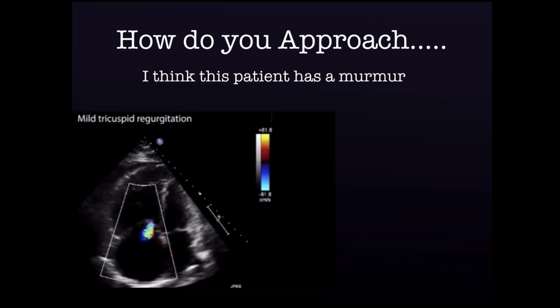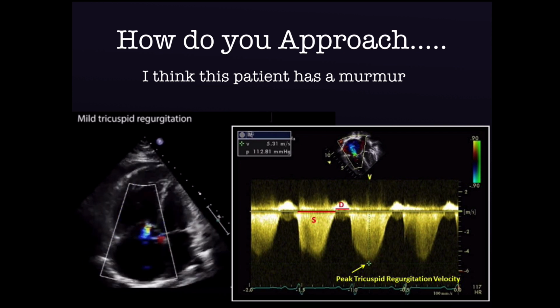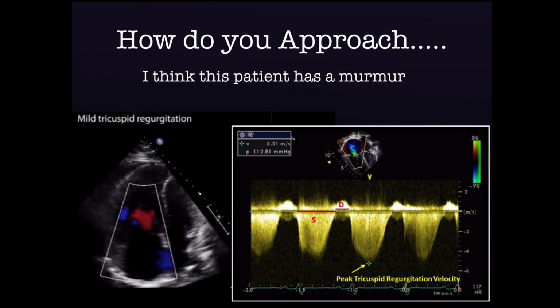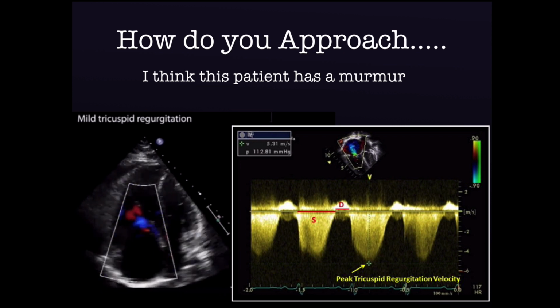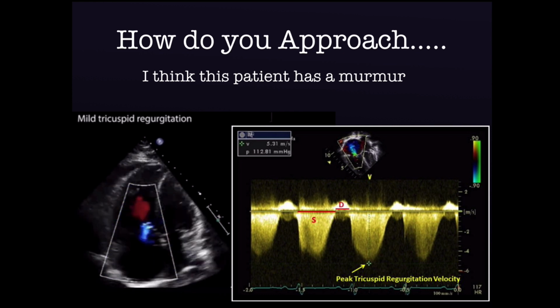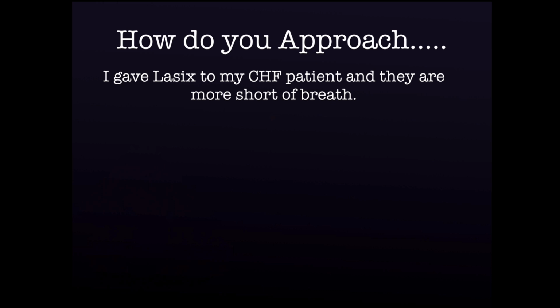Well, with ultrasound, I can show you and I can tell you and I can let you listen, and hopefully it makes more sense when you get there. And then I can even show you more about it. I can show you how fast that velocity is with ultrasound. I can show you how much blood's going through there, and then I can teach you about other things about physiology, such as pulmonary hypertension, things that are almost amorphous when you're trying to explain it as an educator. You're like, how do I explain pulmonary hypertension to you? And how do I explain diastolic dysfunction?